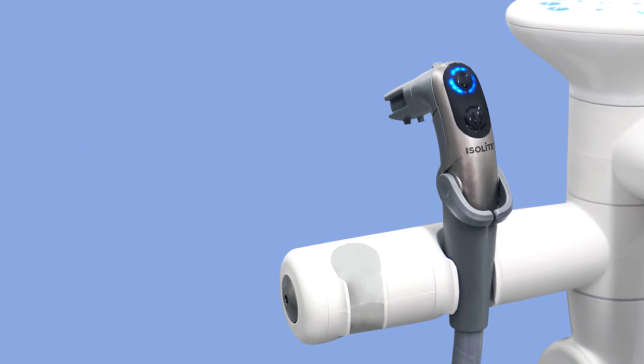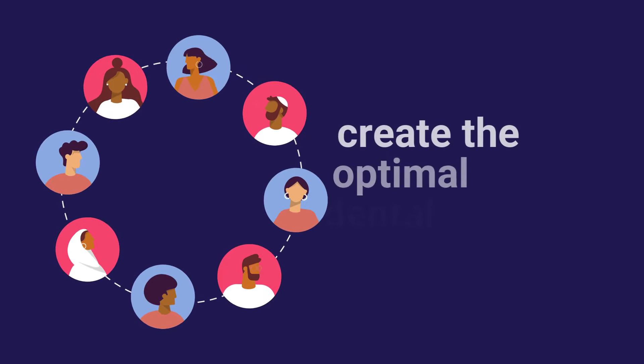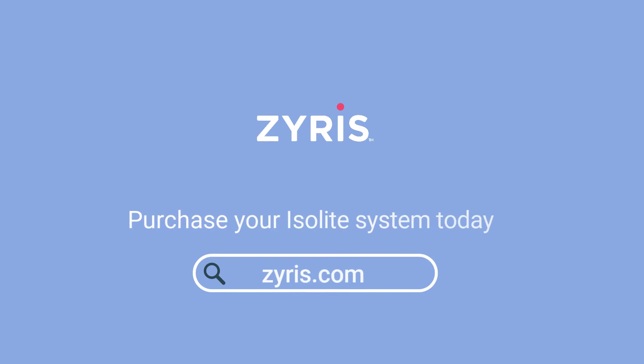With Isolite, you can achieve better clinical outcomes, save time, and work independently. Create the optimal dental experience for clinicians and patients. Schedule a free live demo or purchase your Isolite system today at Zyris.com.